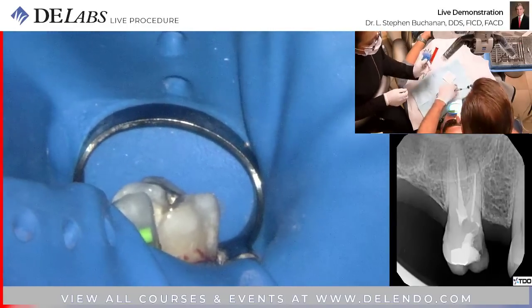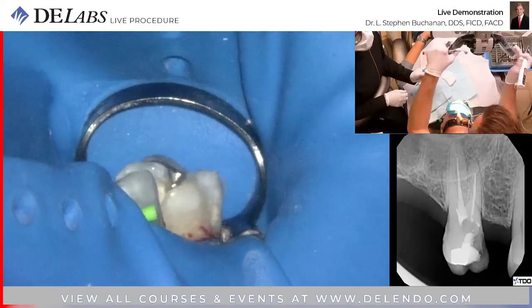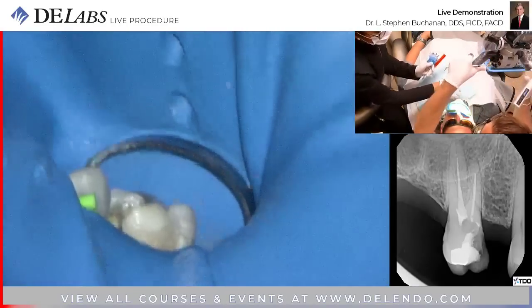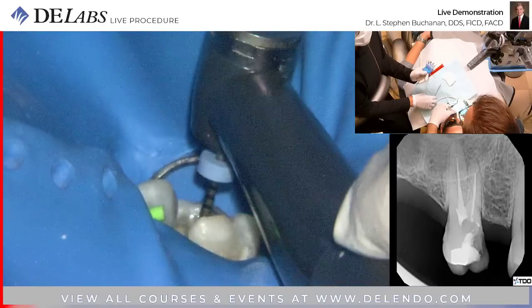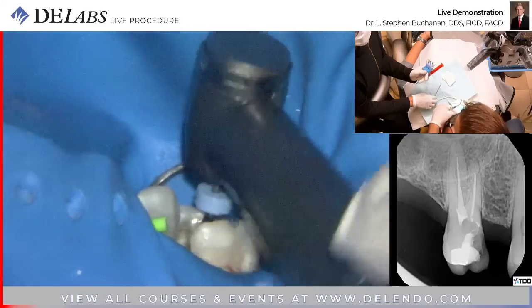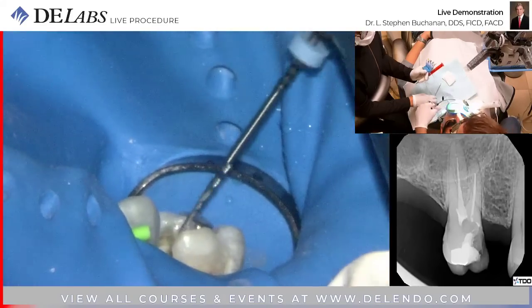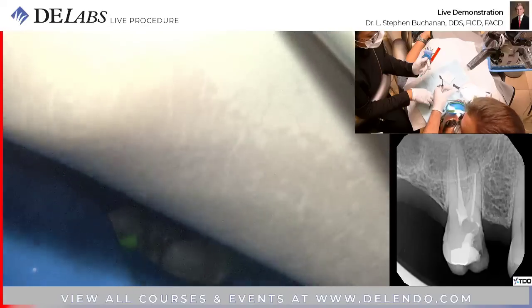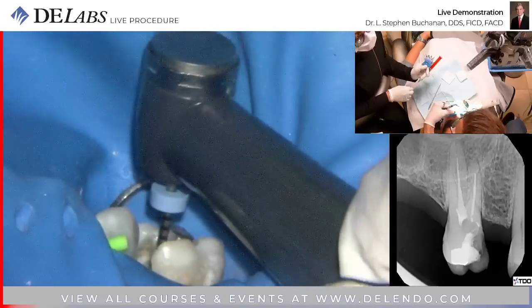I was a millimeter short on that because I've gauged it at a 30. It looks like I don't need a 40/08, and if I put a 40 to length, I'll have to cut a 40/08 shape. So I think this might be the last cut. I'm trying to get a better view of the reference point. Impediments like what you did with MB3, those are stainless steel files, right? Because you have to pre-bend. Right. Until I get 15, and then I'm going to bend the 1504, 1506 Vortex Blue. Okay, probably final cut.